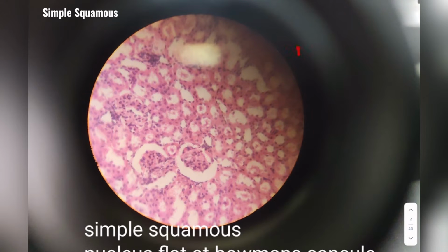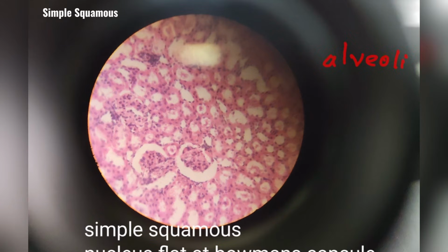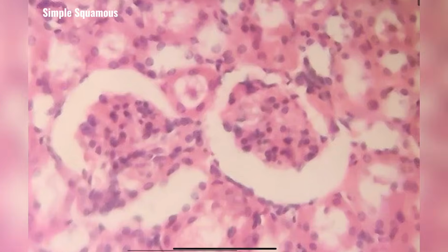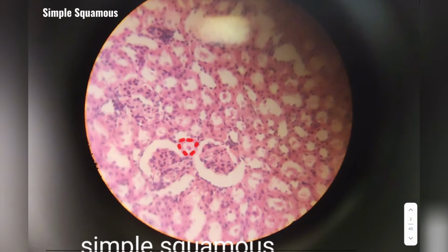What you have here is a section of Bowman's capsule. It could also be alveoli. Either way, whether you are provided with a section of Bowman's capsule or alveoli, you'll be able to observe one thing, and that is spaces. As soon as you observe the spaces, you can guess that this has to be simple squamous epithelium. For assurance, you can observe that there are these flat nucleus, and these flat nucleus are present in a single layer. So this has to be simple squamous epithelium.